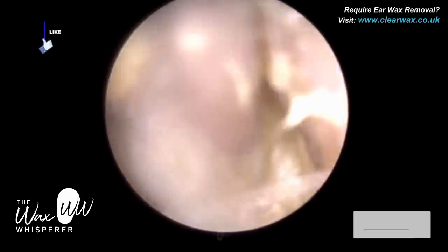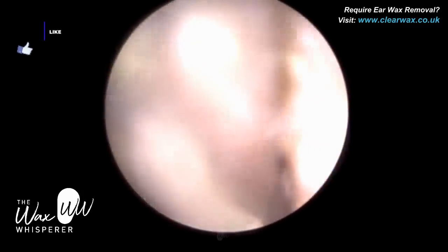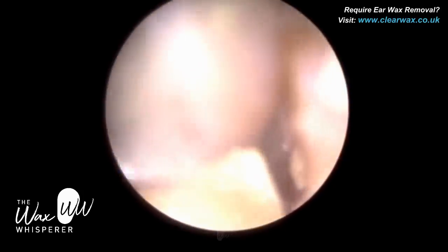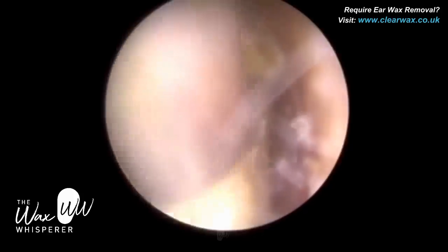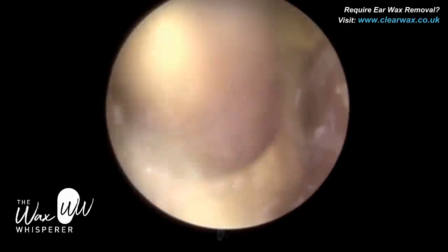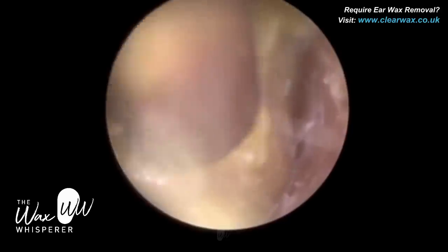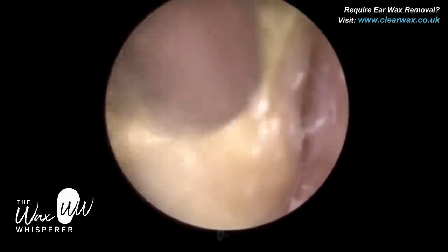We've just started off in the right ear. The consistency of the earwax between the right ear and left ear is completely different. In the right ear, which is the ear we're in at the moment, the earwax is a very soft, mushy consistency — similar to mashed potato. If you've been watching my videos for a while, you'd be aware that I quite often make food comparisons with the consistency of earwax. I think it's just something that we can easily relate to.